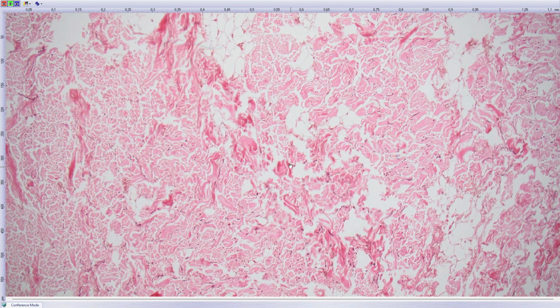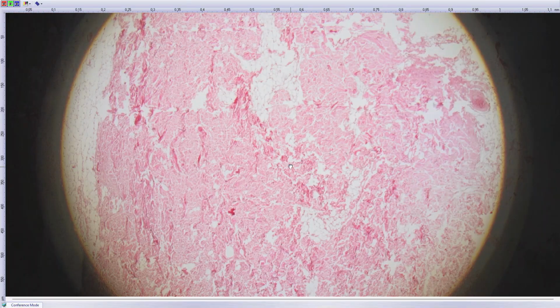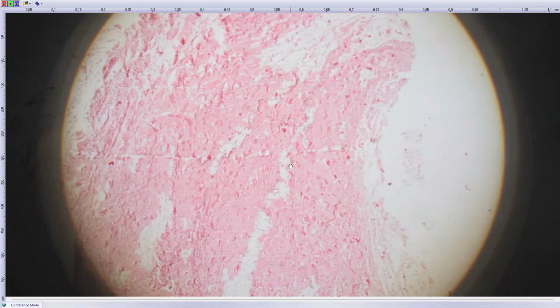Here I have another. It's a patient having many lesions over the body. It is the lesion on the neck. I'm sorry, I didn't get the block. I got the H&E slide, which is not of best quality.